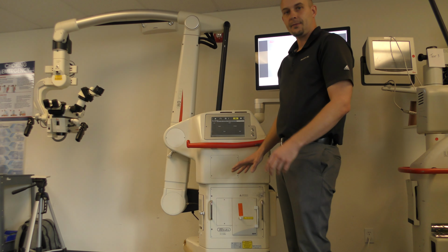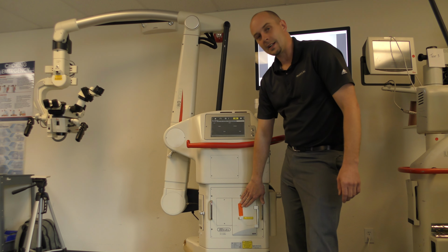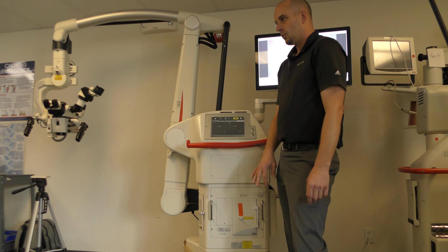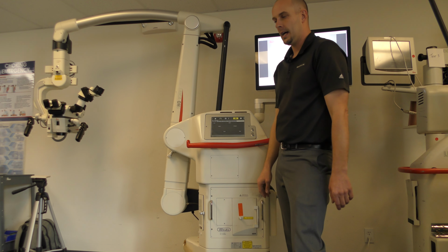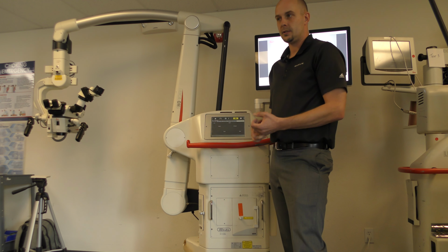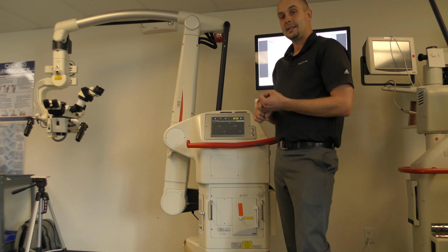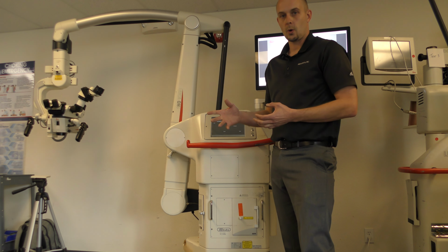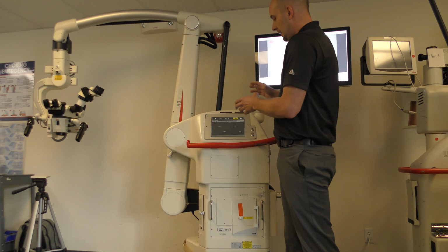If I see discrepancies, and I've seen a whole array of things, I've seen a 300 watt and a 400 watt, I've seen really old bulbs in the system, hour counts just erratic, a variety of different things, this is an opportunity to inform the staff, teach the staff. So I actually take the time to reach out to the coordinator, and I'll explain to them, listen, same thing I just said to you.